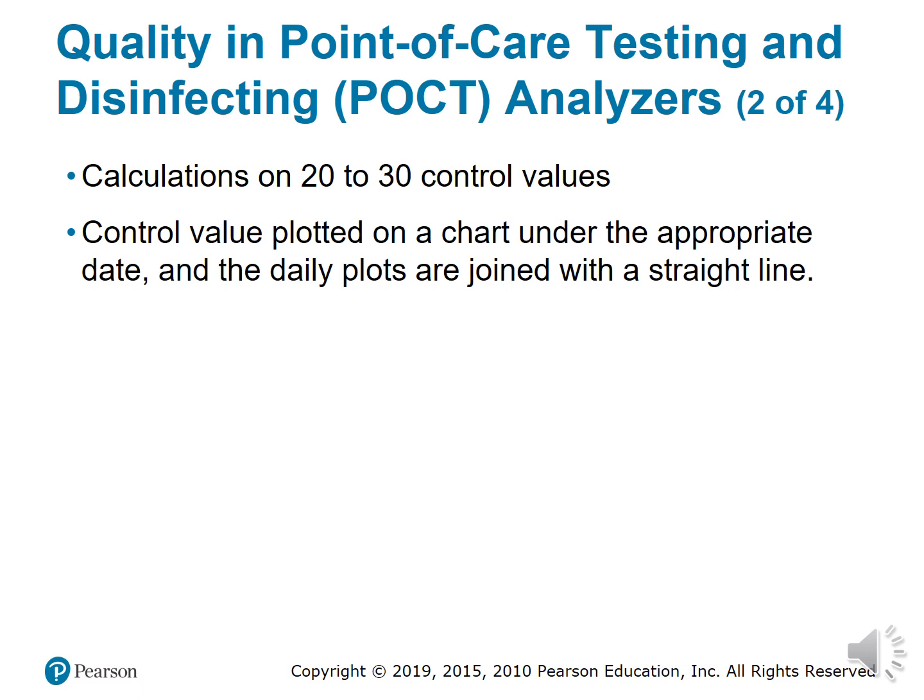When you are doing quality control testing, always make sure that you document. What I've always said, you have to document pretty much everything you do in the hospital, especially when it comes to quality control of a POCT analyzer. You have to document what time, what day, which POCT you tested, and what the results were, and was it accurate, and did you have to recalibrate it?